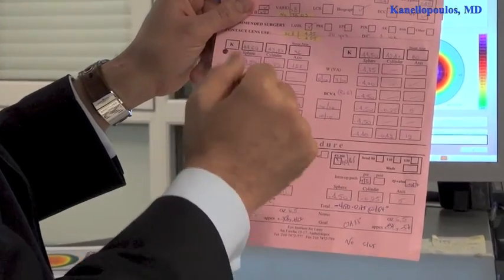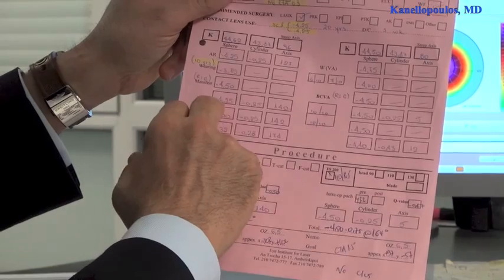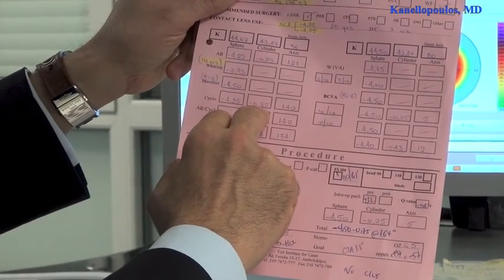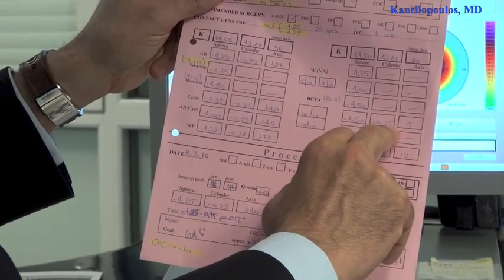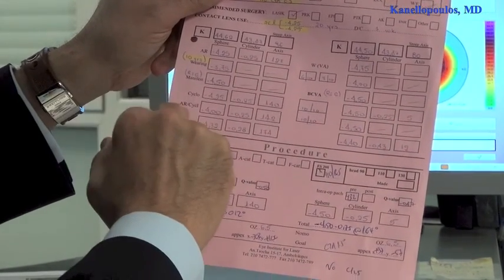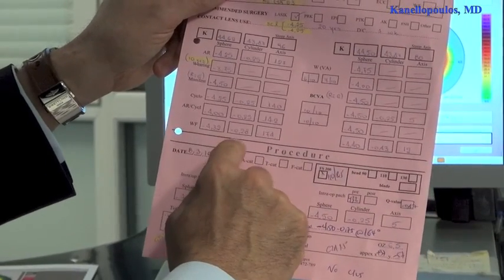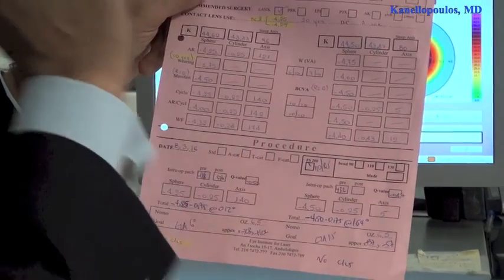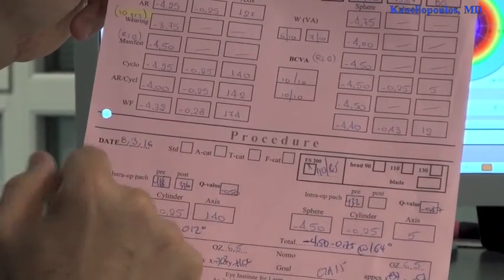The cycloplegic refraction with one drop of tropicamide, minus 4.25 and minus 0.25 of astigmatism. Minus 4 and a half, 0.25 of astigmatism left as well. The auto refraction post-dilation and partial cycloplegia, which is the same. And the wavefront measurements, which do show, confirm the prior refractions.